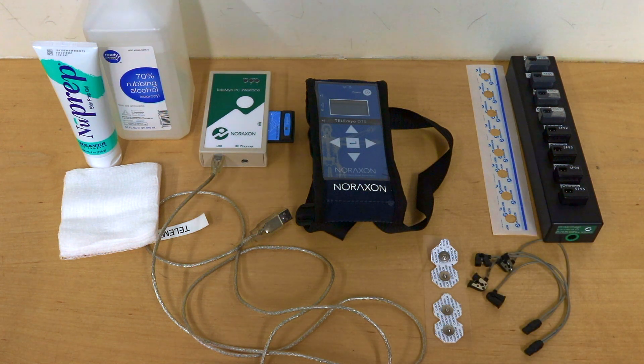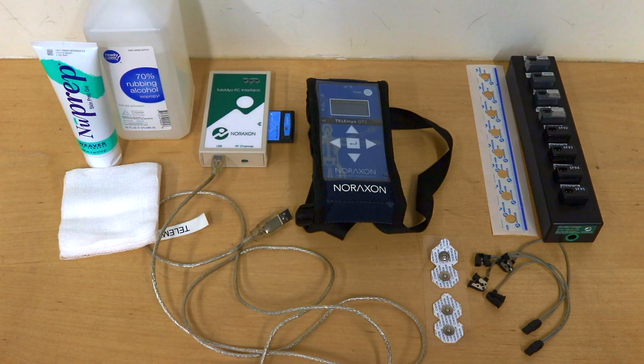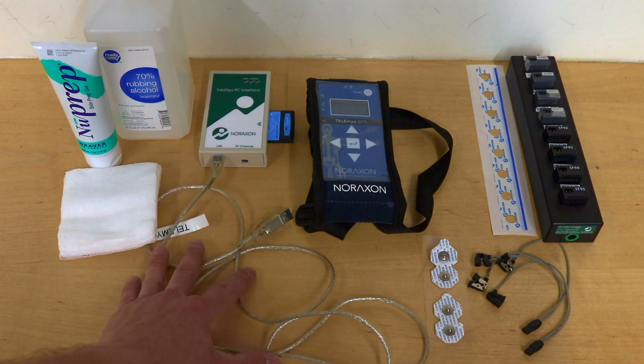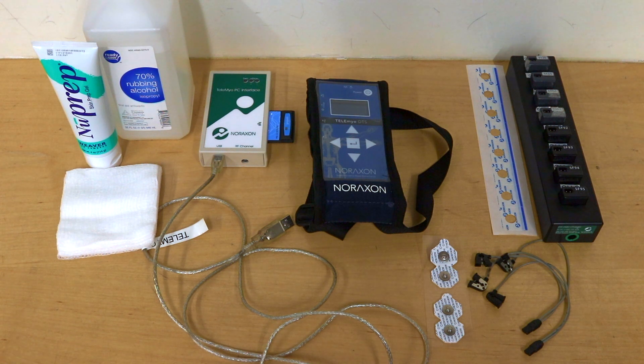We'll also need our EMG wire connectors which will connect the sensors to the electrodes. After that we'll need something to pick up what the sensors are giving out — that's going to be our TeleMyo DTS, which is just a receiver. We'll also need our TeleMyo PC interface which will allow the receiver to connect to our laptop with the Noraxon EMG software.